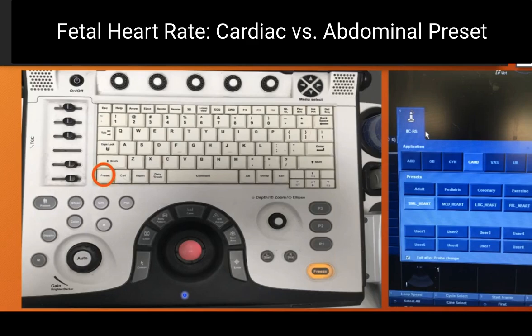I will use the Logiq E point-of-care ultrasound machine. In your practice, you may have a different machine, but the majority of modern machines will have different presets that will allow you to get the fetal heart rate by using M-mode.